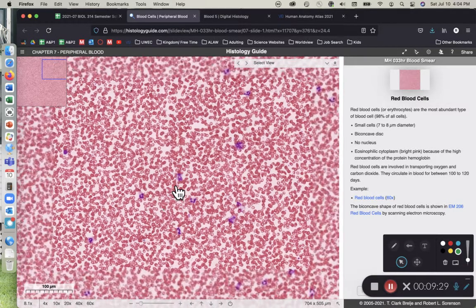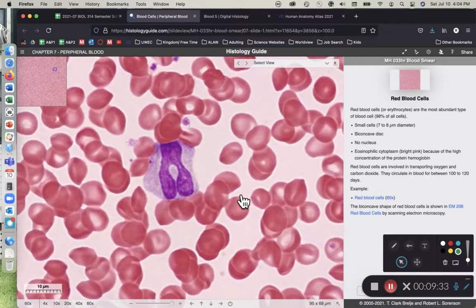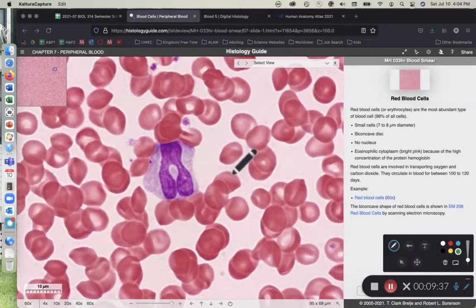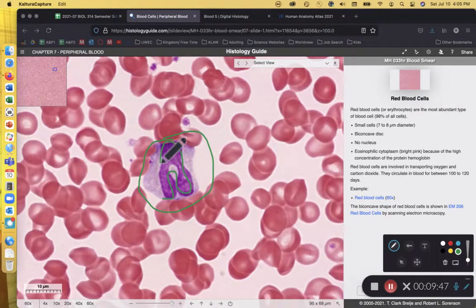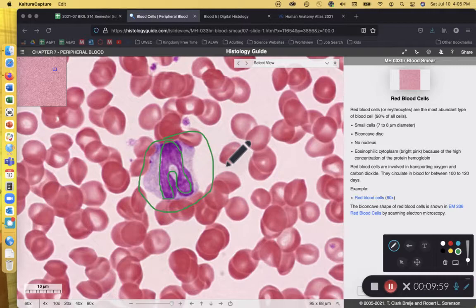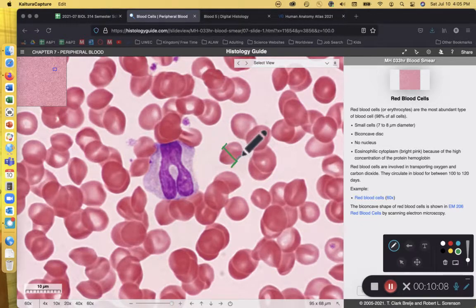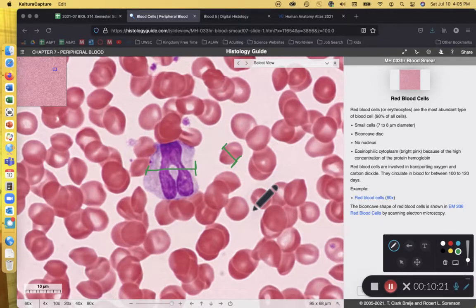There are a couple of monocytes. Let's look at this one here — this is a very stereotypical monocyte. Monocytes are among some of the largest leukocytes in our bodies. As we look at the monocyte, we can see a horseshoe-shaped nucleus. Instead of having a segmented or multi-lobed nucleus, the monocyte has a horseshoe-shaped nucleus. I also want to emphasize the size — using our erythrocytes as a frame of reference, a monocyte is more than double the diameter of an erythrocyte.